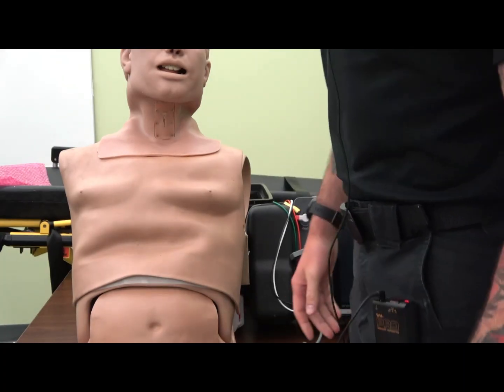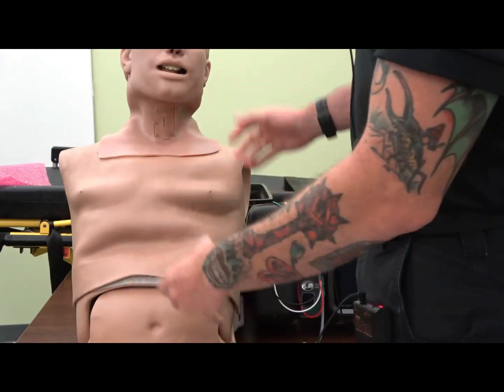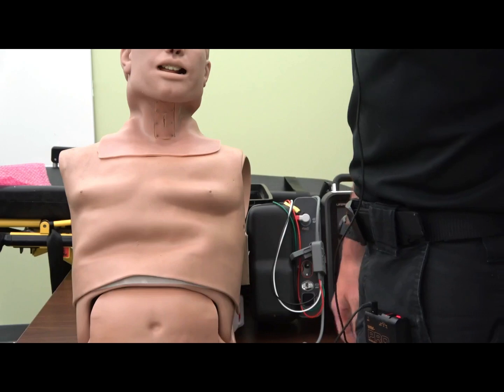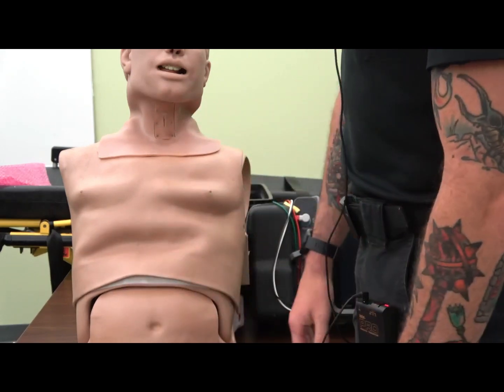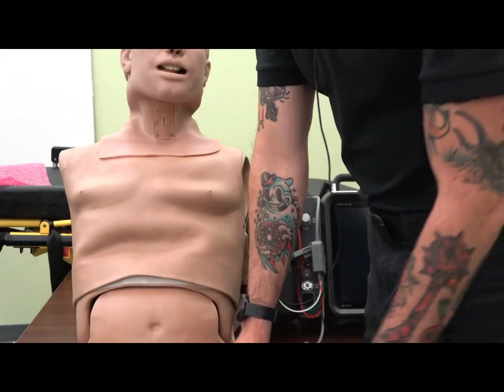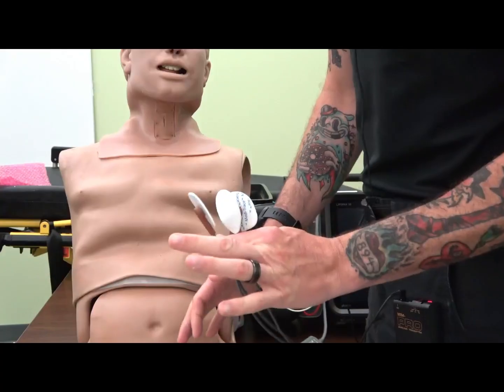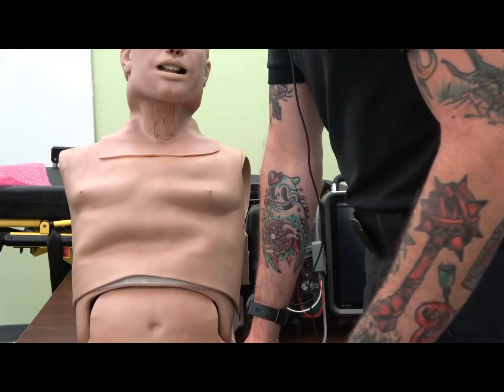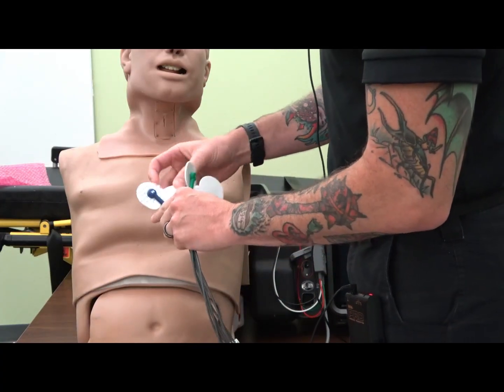Now we're going to talk about applying the 15 lead. Due to the mannequin that I have, it doesn't have limbs, so I'm going to omit the limb leads, but those go on the limbs, not the torso or abdomen. So we're going to be dealing with the V leads as well as the extra 3 leads for our 15 or expanded 12 lead. So let's start with V1.